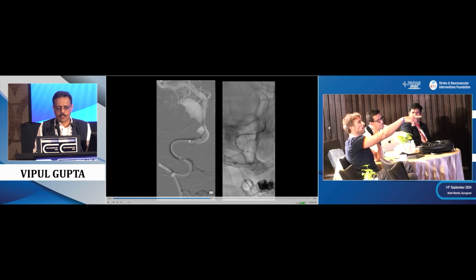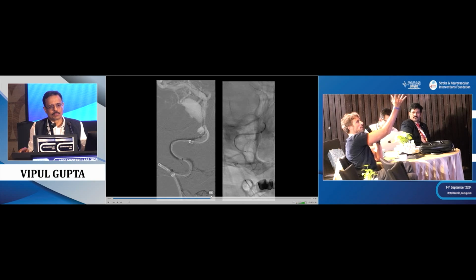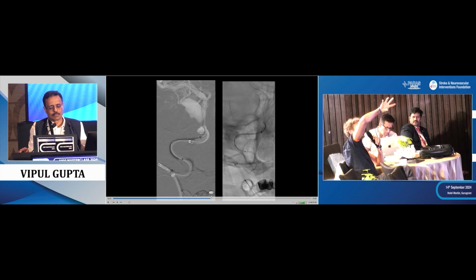Okay, that's fine. You can see here your microcatheter twists. But in order to arrive in the M1, it did like this, like this, like this, and finally got to the M1. So in M1, you are deploying 1 centimeter, but the stent is fixed now in this direction.